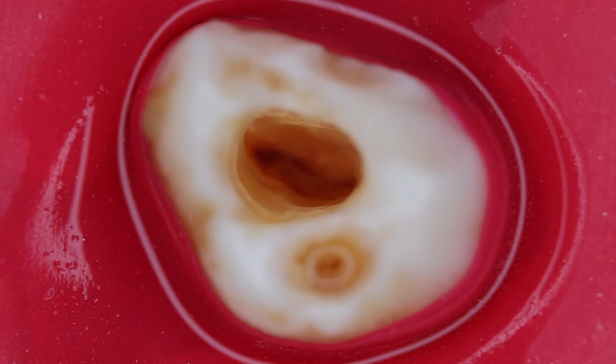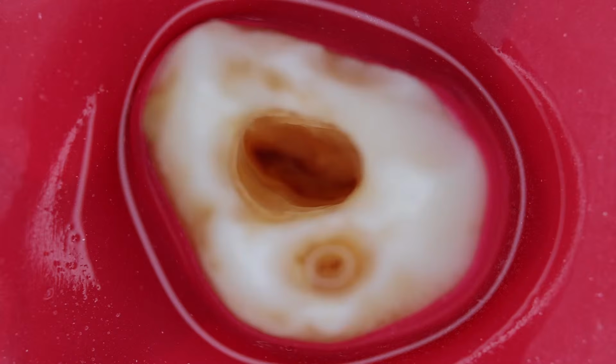Now what is the difference that you are going to consider, that is, why not take it with the radiograph? You can take a radiograph to get confirmation that your file is going into the roots and that you are not going into any perforations. For that verification you can take the radiograph. Otherwise, when you have a good quality apex locator, that is sufficient to determine the working length, and then you can proceed further.